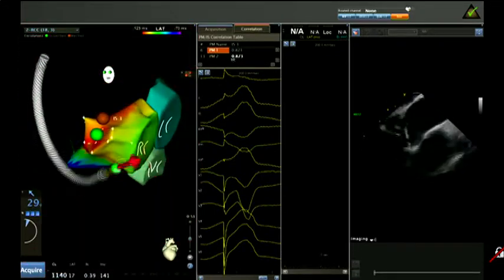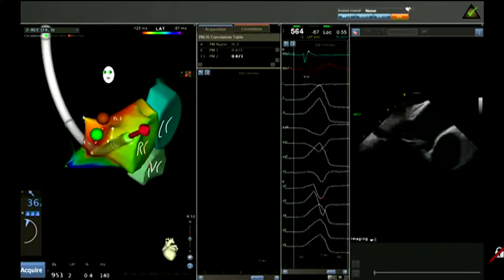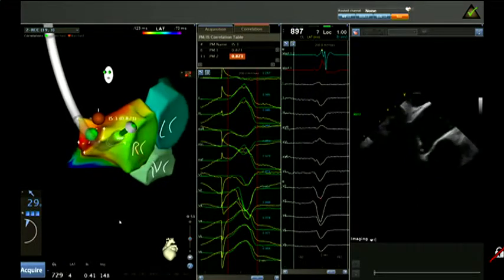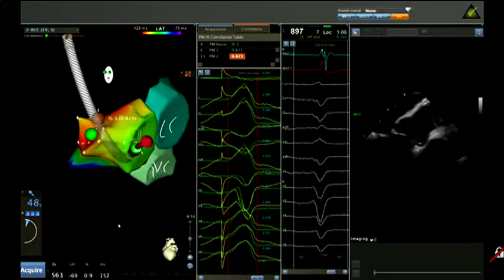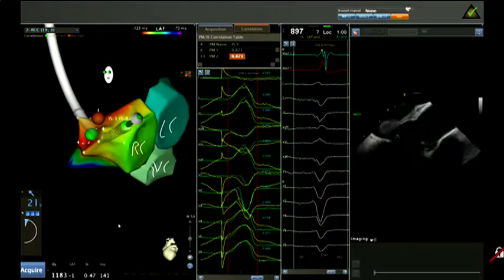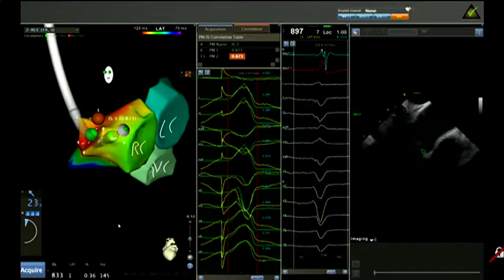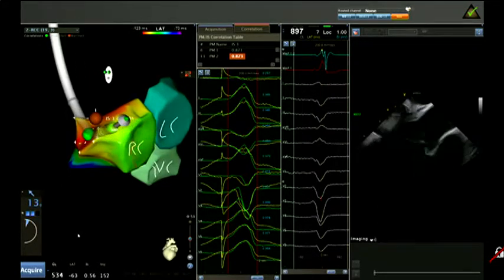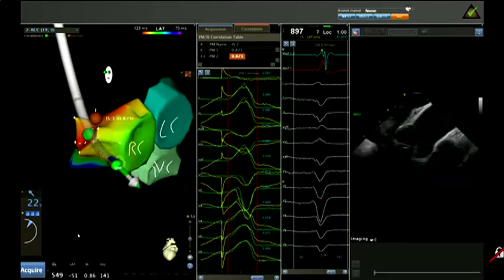But when you do pacing, that may increase up to 2.5 centimeters. So in an area of 2.5 centimeters, you can have exactly the same pacing. That's important to remember because these are the limitations we have. When you guide a procedure exclusively through pacing, the procedure may fail because you could be at the extreme of those 2.5 centimeters of area, giving a good pacing, but not necessarily at the source.